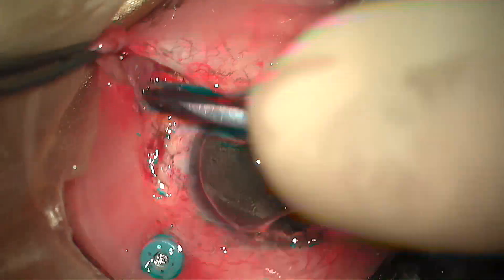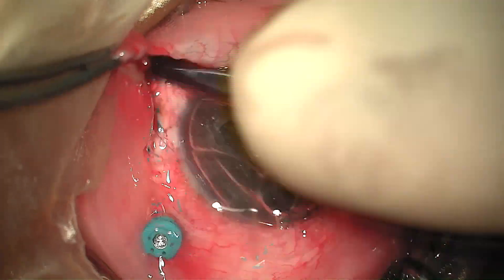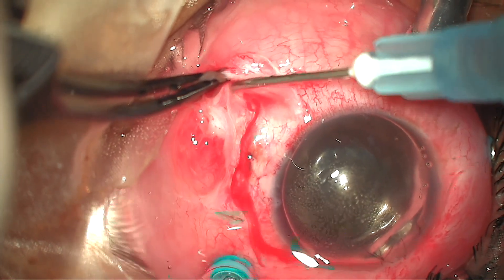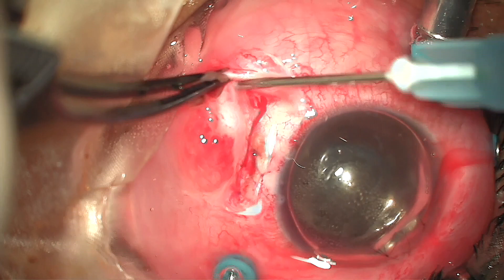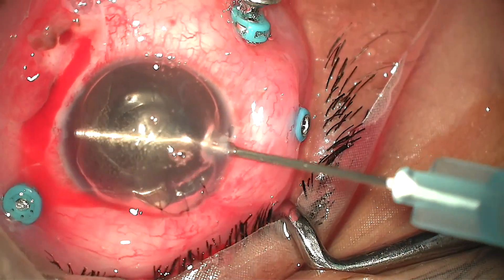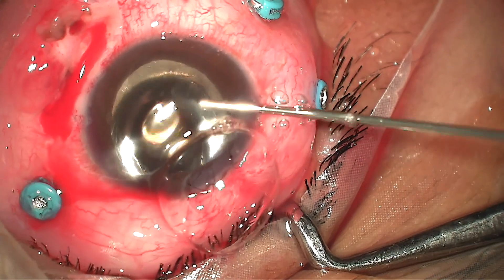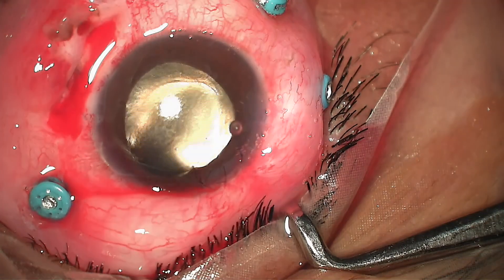Moving on, I completed the rest of the vitrectomy followed by fluid-air exchange. The effect of peribulbar anesthesia was wearing off, so sub-Tenon's anesthesia was given to complete the rest of the surgery. Following fluid-air exchange, air in the anterior chamber was hindering visualization, so viscoelastics were injected into the anterior chamber and the air was removed.